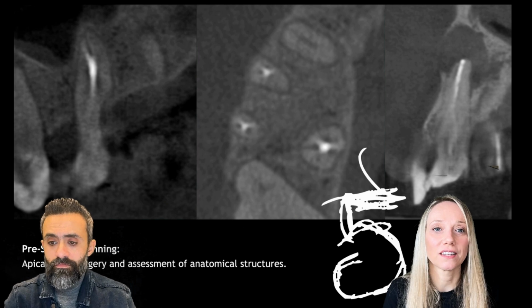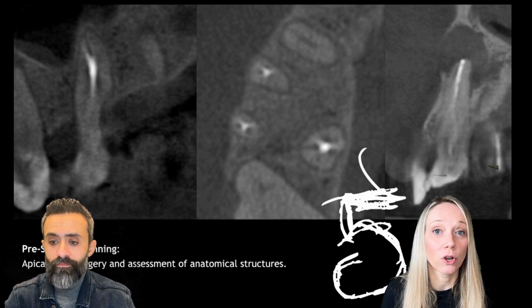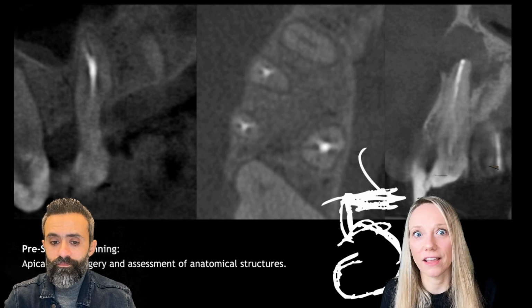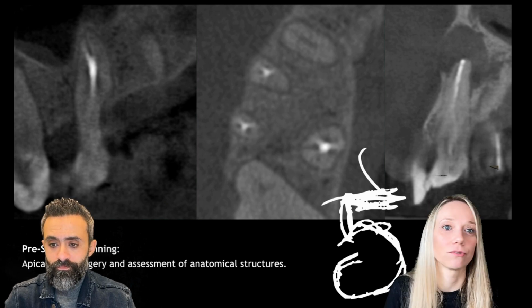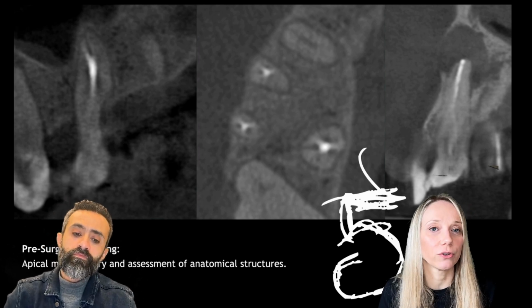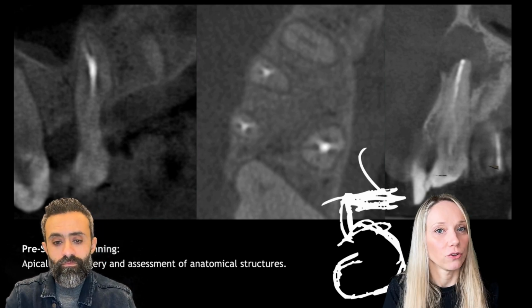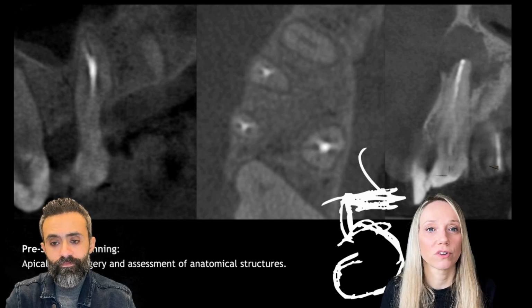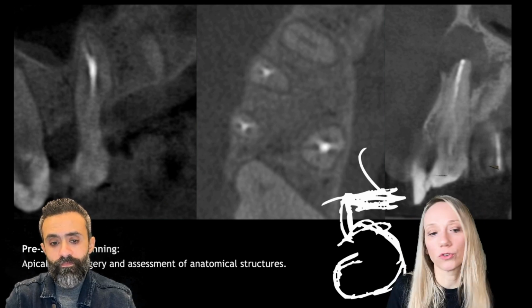You know in advance if you are going to end up close to some very sensitive structure like the maxillary sinus, the alveolar nerve, etc. And so, according to that, you can plan your flap, you can plan the osteotomy, you can plan if you have to use, for example, piezo surgery or you don't need it.